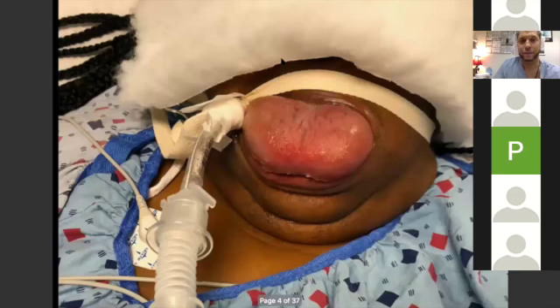So you're going to certainly see this on your oral boards, right? On your oral boards, your examiner will give you a patient who they paint the picture of being difficult to ventilate. And the quickest way to fail your oral boards is to put that patient to sleep. So when in doubt on your oral boards, if ventilation is challenging, be prepared to give your technique for an awake technique. This is a patient of mine with angioedema, right?